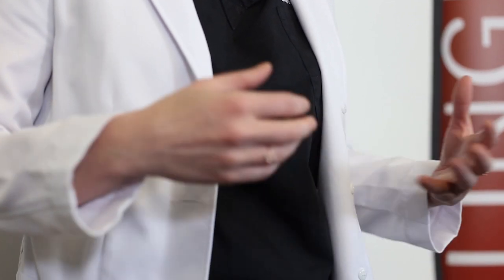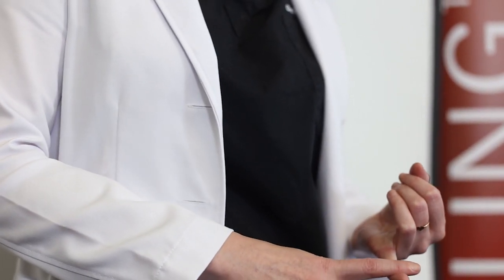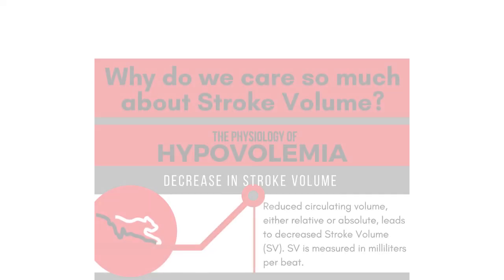So how do we actually use this information in taking care of our patients, right? Really the same way that we always have. It helps with the decisions that you are already making. Of course, it starts with, do I have a pressure problem? Do I have a blood pressure problem? Do I have a perfusion problem? I'm going to be looking at my MAP, and I'm going to be looking at my other clinical signs. And then we're also thinking, is my patient unstable, or are they becoming unstable?